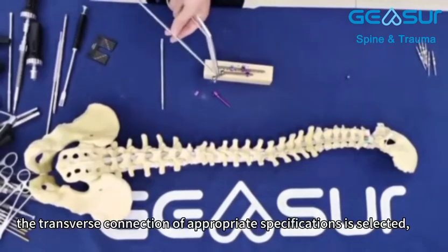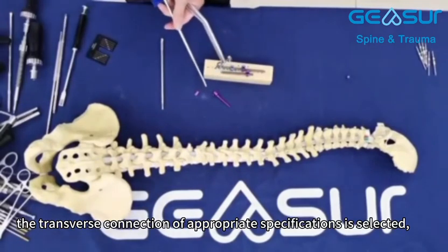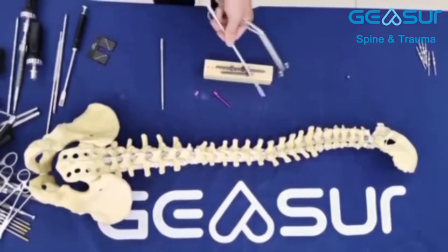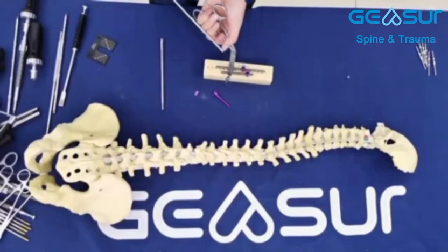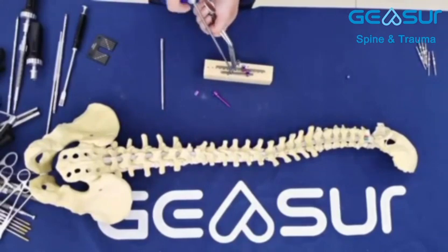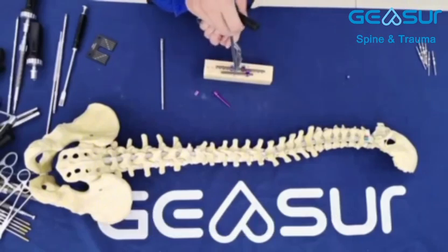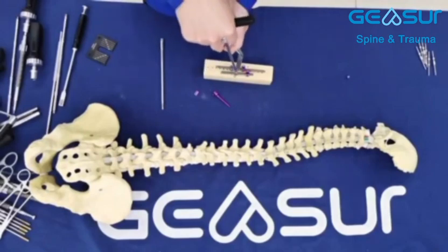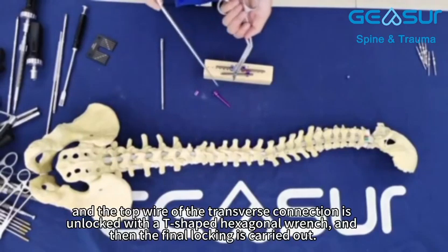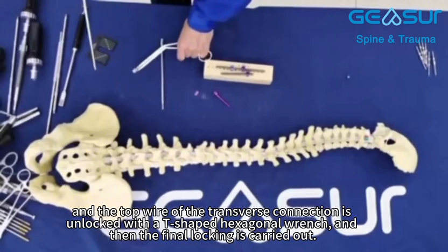The transverse connection of appropriate specifications is selected. The transverse connection is held with the transverse connection clamp, and the top wire of the transverse connection is unlocked with a T-shaped hexagonal wrench, and then the final locking is carried out.